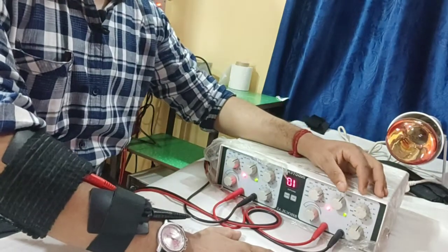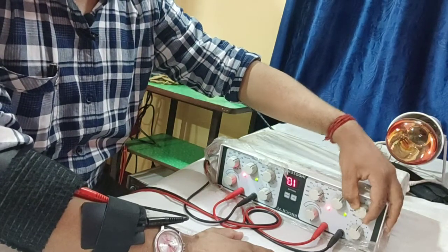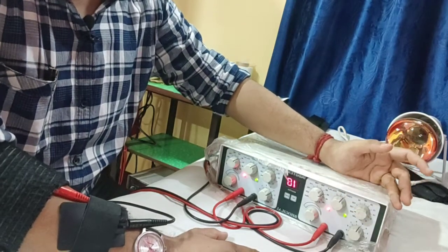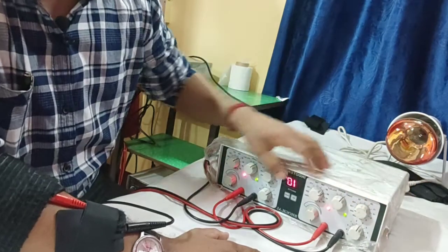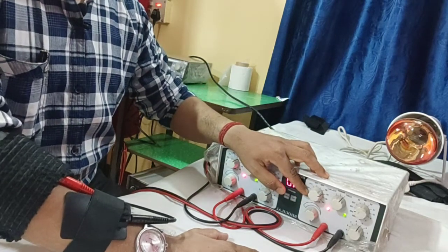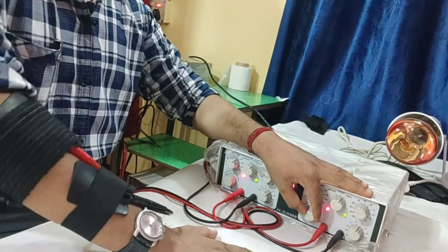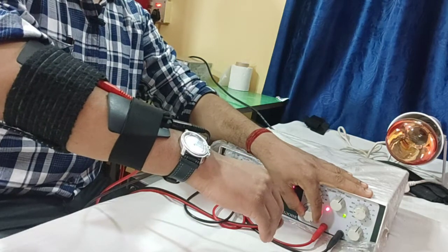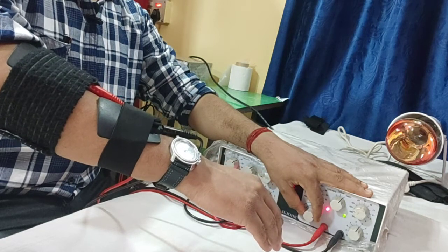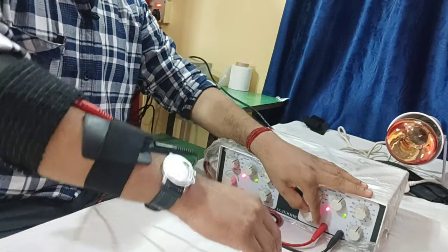So now I will show you, we decided the conventional TENS now. I kept the frequency knob as high. As I told, the frequency knob for the conventional TENS is supposed to be within 100 to 180 hertz. So I kept the frequency knob over here, and I kept this pulse width knob within 20 to 80, as low. So high frequency and low pulse width, and the knob is in the frequency part. Now I will increase the intensity, and I will show you how the contraction looks like. As the intensity is getting increased, I can feel the contraction over here.